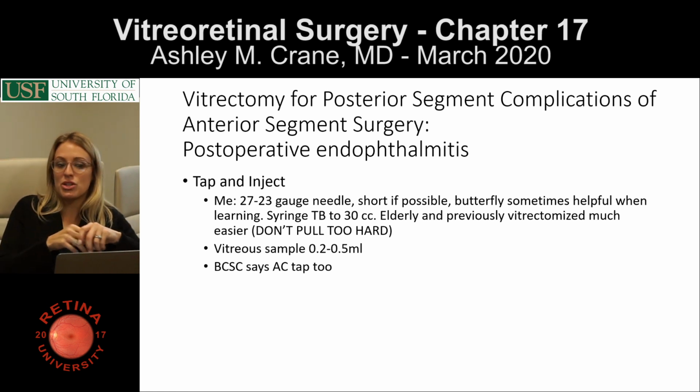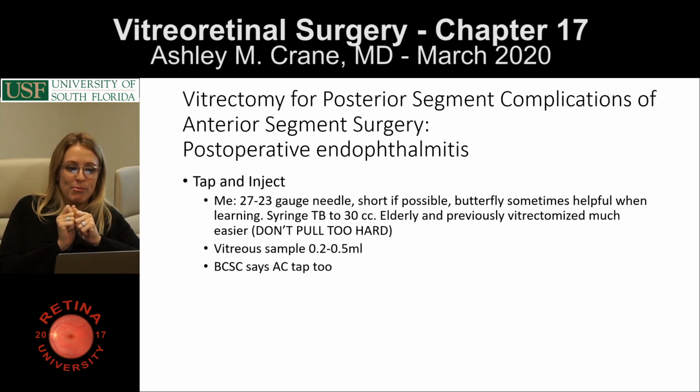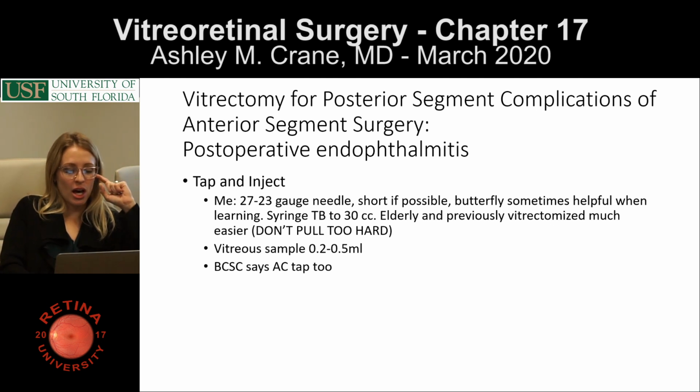And so you might have to use a huge syringe, and I've seen 30 cc syringes being used for this, which can be really dangerous the moment you actually get the sample, because you can really collapse the eye and cause a major problem. So be careful with young people and with large syringes. I prefer using a bigger needle and a smaller syringe. That seems safer to me than creating all this negative pressure.